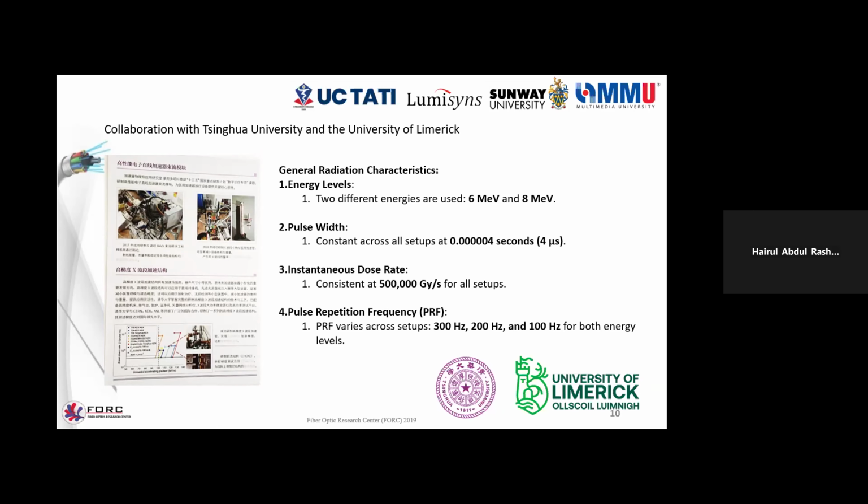It's set up in the lab, available for 2 different energies, 6 MeV and 8 MeV, with a pulse width of 4 microseconds and dose rates up to 500,000 grays per second, and has a pulse repetition frequency that can be varied from 100 to 300 hertz for both energies.